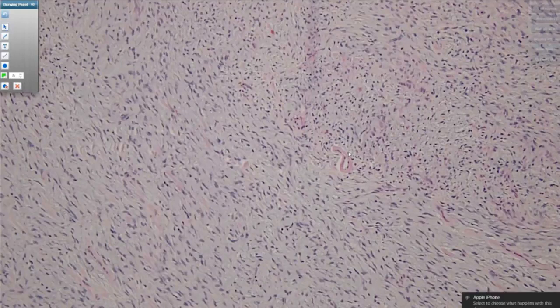So again, we do beta-catenin labeling to support a diagnosis of fibromatosis in the correct histologic setting, but nuclear beta-catenin labeling alone does not make a lesion fibromatosis. And I'm talking particularly in the breast here, where our differential includes metaplastic carcinoma and phylloides tumors. It's obviously different in soft tissue sites.